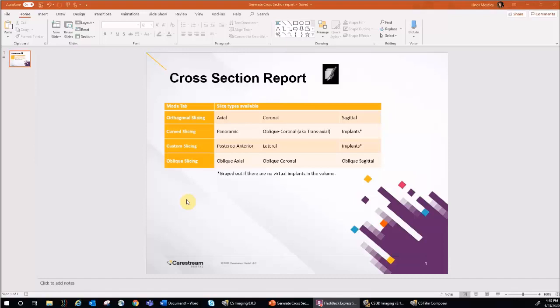For custom slicing, you can choose posterior anterior, lateral, and implants. And for oblique slicing, you can select oblique axial, oblique coronal, and oblique sagittal. Please note that for the implant cross-section report, virtual implants must already be in the volume.